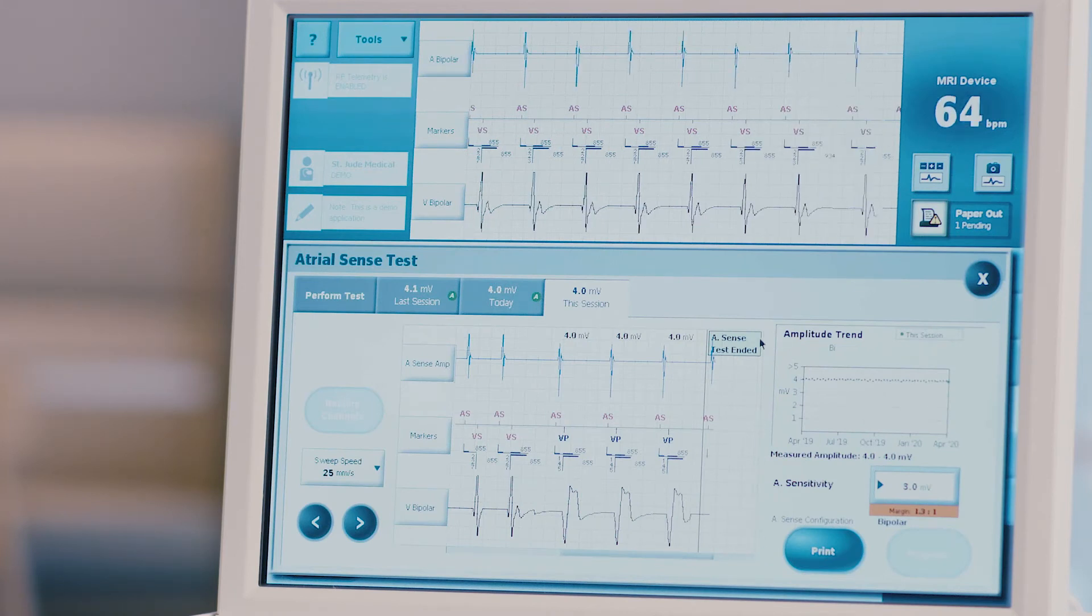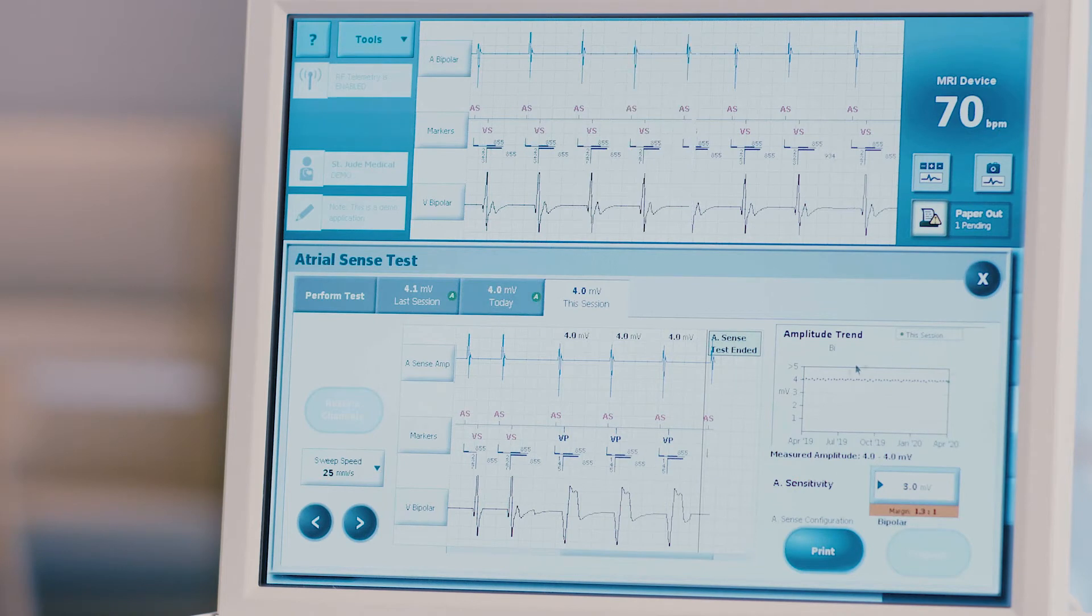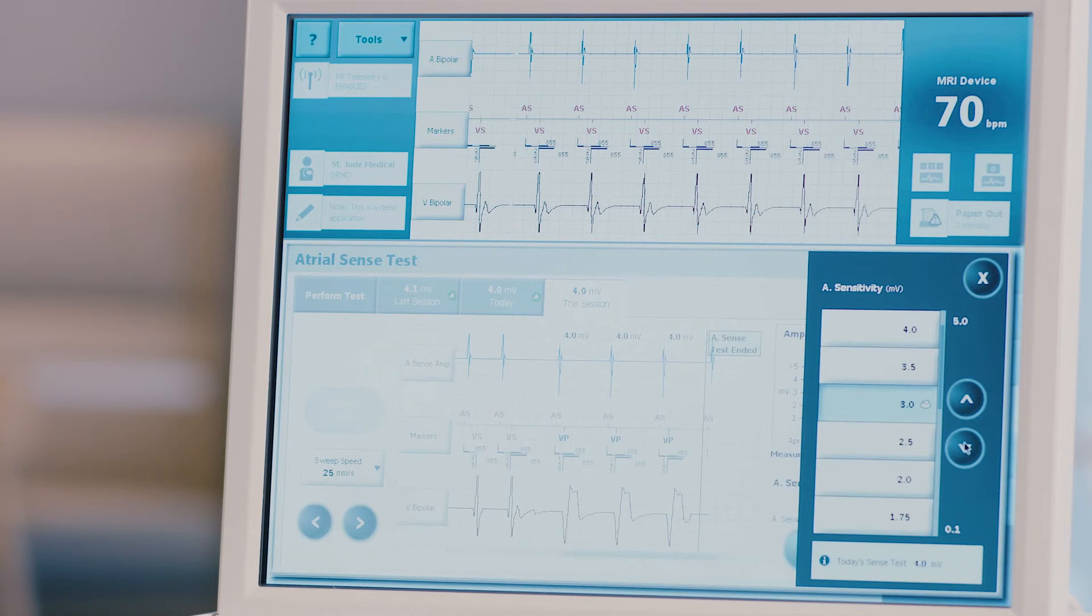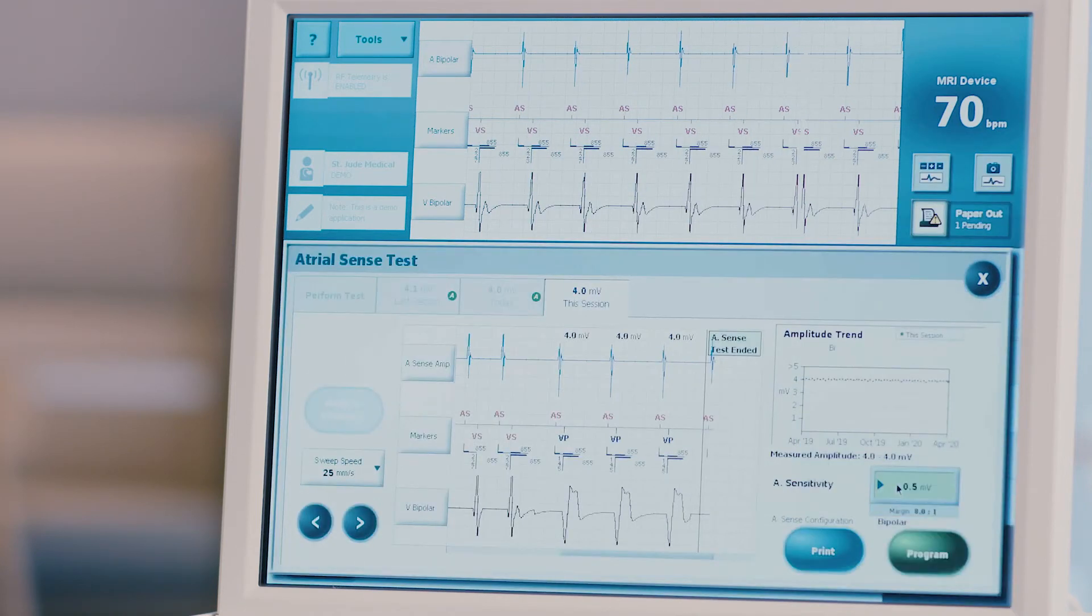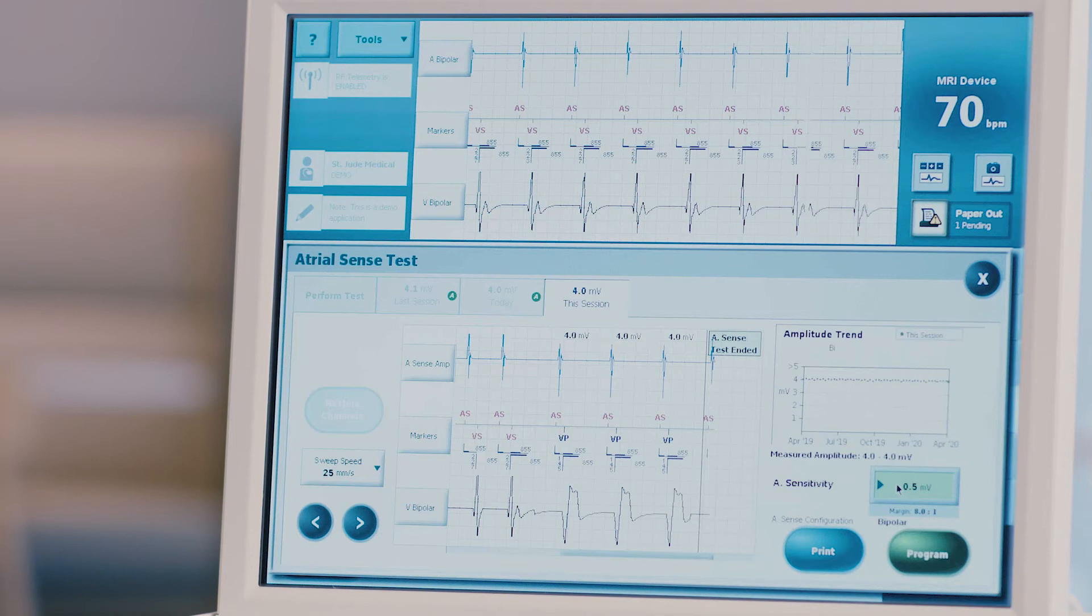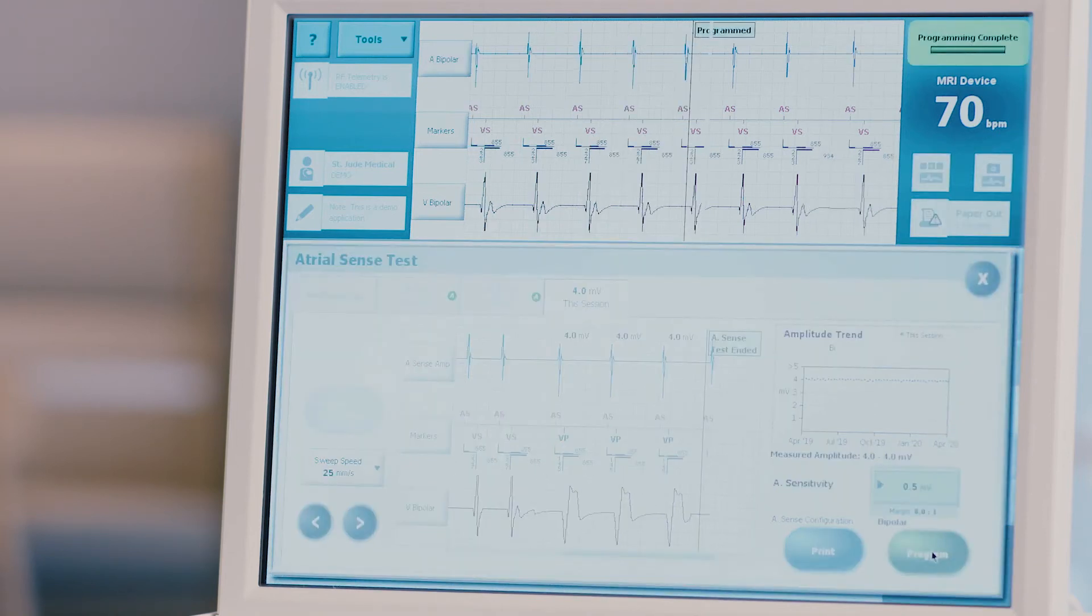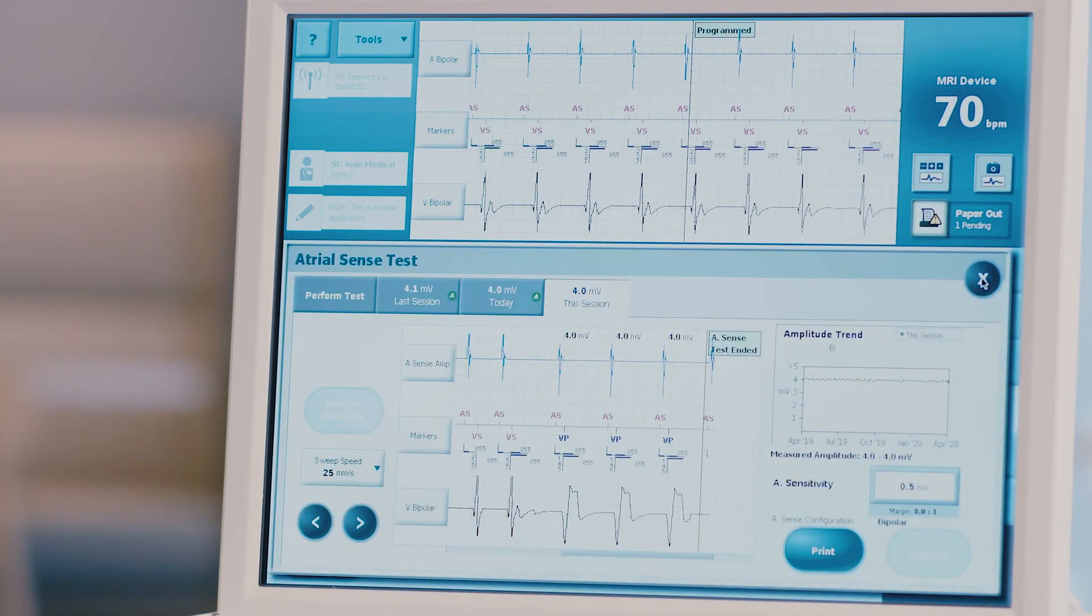After the test is completed, a freeze capture of the EGM screen is displayed. Note any trend data provided on the right side of the screen. Permanent programming changes can be made to each setting directly from this test results screen, only in the presence of a healthcare professional or certified Abbott employee, by choosing the desired setting and clicking the green program button. Press X to close the screen and return to the test page.